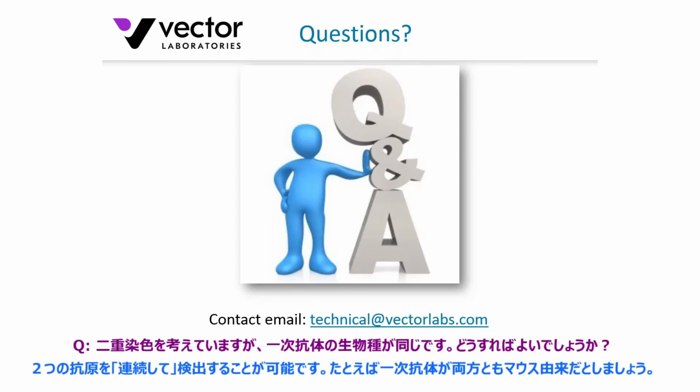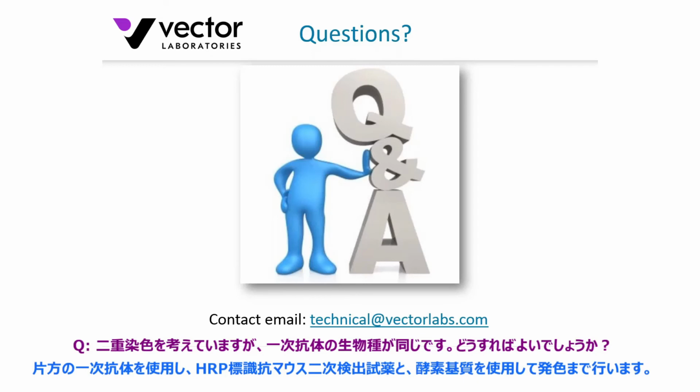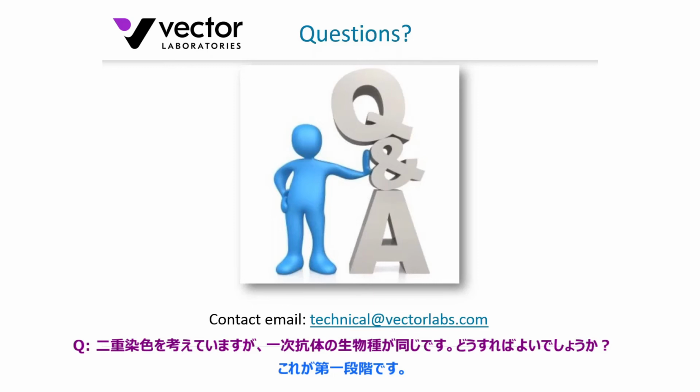Yeah, for immunohistochemistry, we've found actually that if you run those sequentially, and what I mean by that is you'd apply the first primary antibody. Let's use the example of a mouse primary antibody first. You'd apply an anti-mouse, let's just call it a peroxidase-based detection methodology, and then develop with the enzyme substrate. That will be your first label. So that's from primary right through to color development. Then you would apply the second primary antibody, again a mouse, then the anti-mouse, it could be alkaline phosphatase or peroxidase, and then develop that second enzyme substrate. So performing that sequentially works very well with immunohistochemistry.